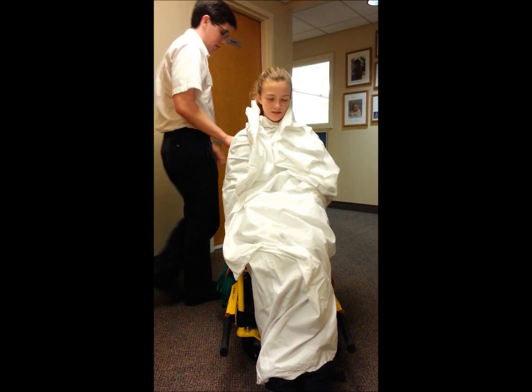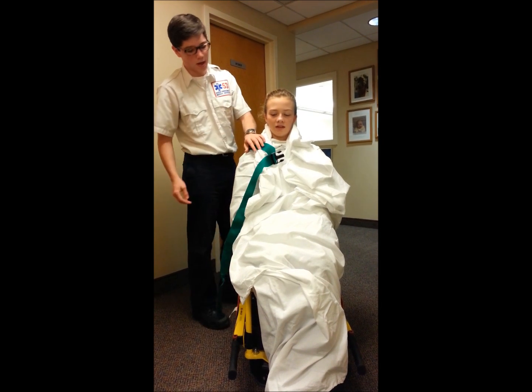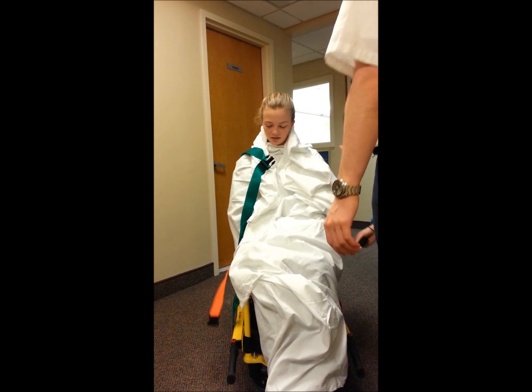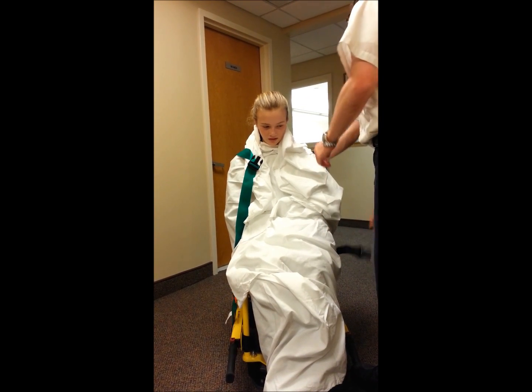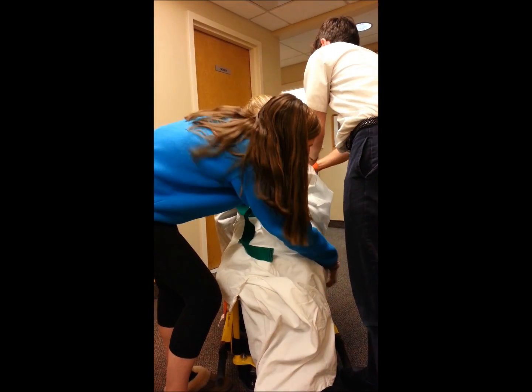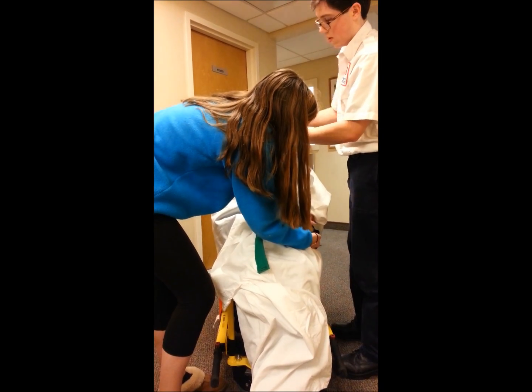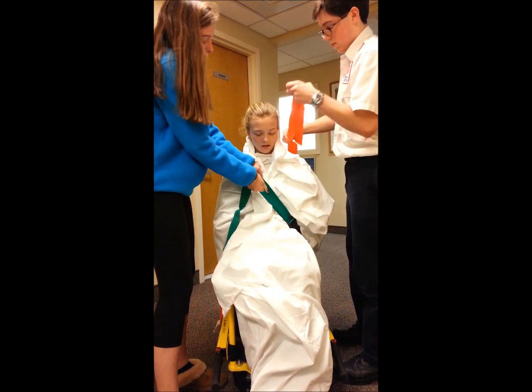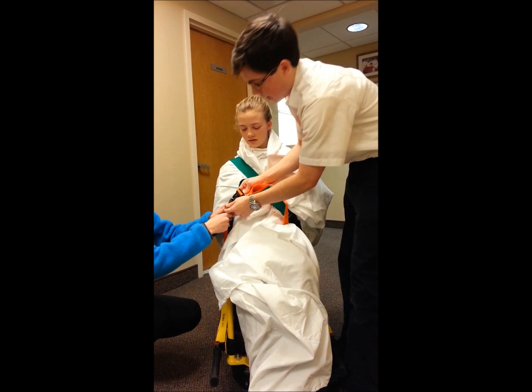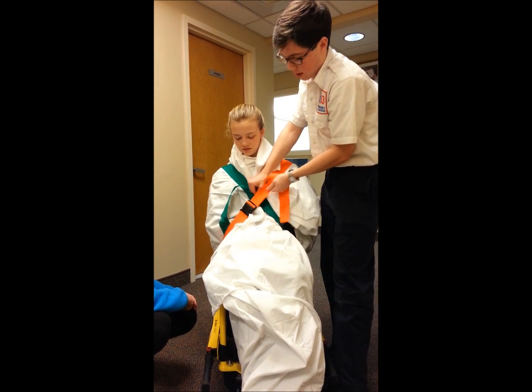Then you want to start strapping them in. What you want to make sure with the straps is that they go over the shoulder. When you're closing them up, they go across the chest like that. Feed them both so you can pull it like that. Make sure it's tight.